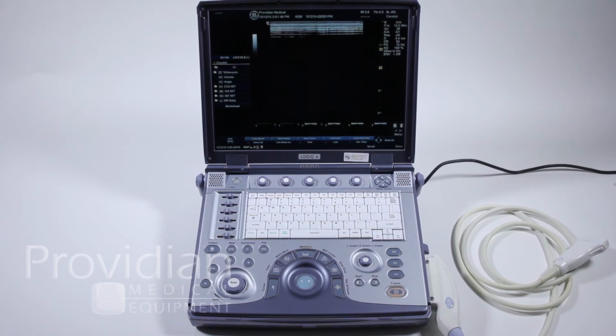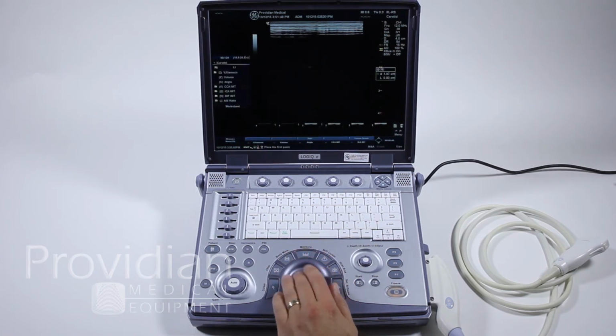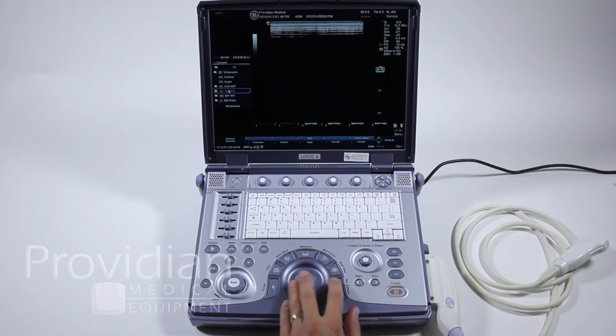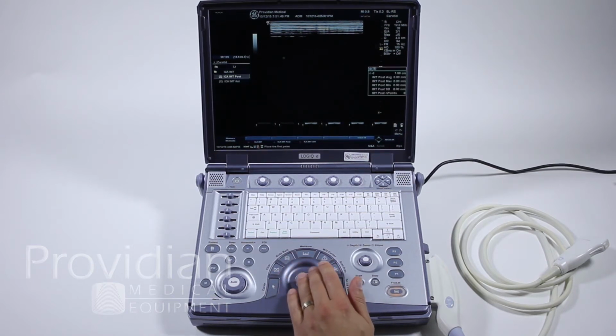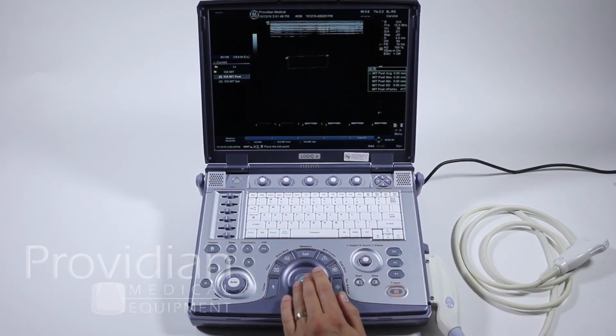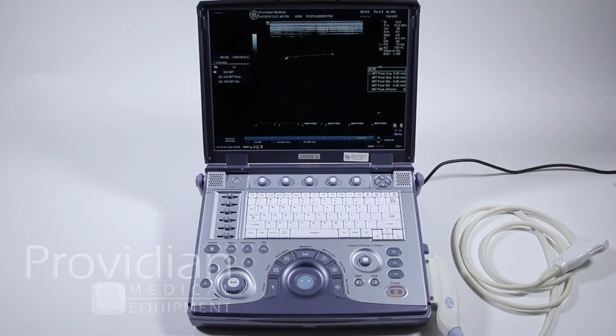Now if I want to make a calculation, I'm going to hit measure again and I'll select the measurement I want to make from this menu over here. So I can select that measurement and the results box will show live results based on the measurement that I made. Again, you can make the different adjustments and save your measurement there.